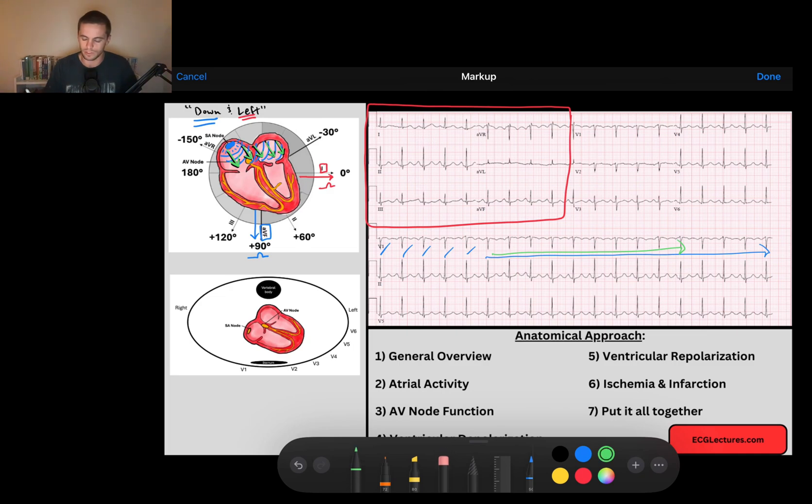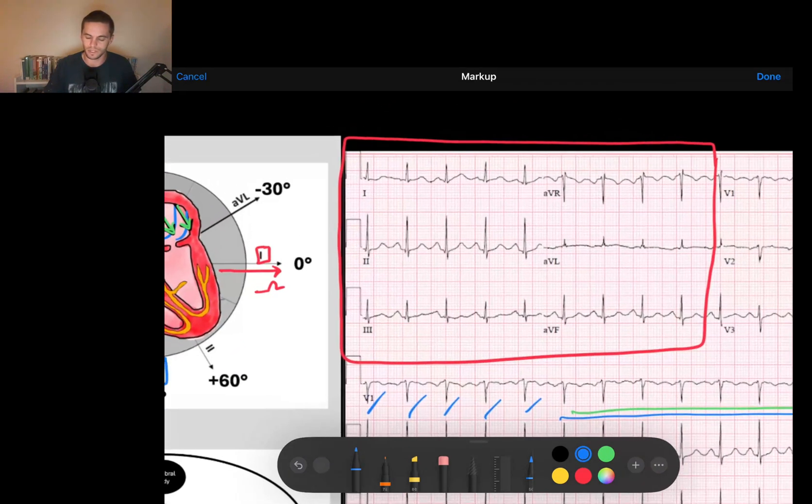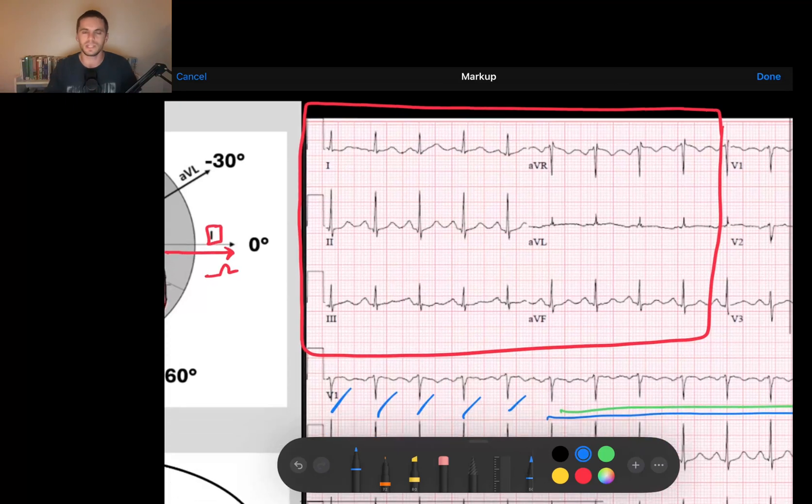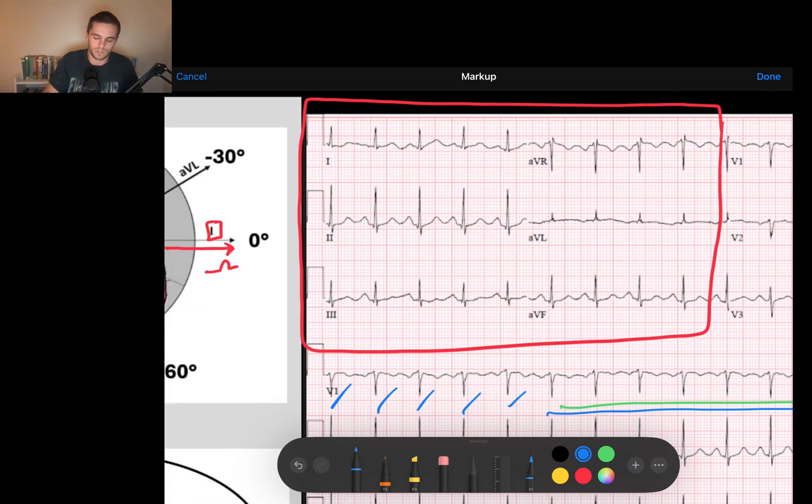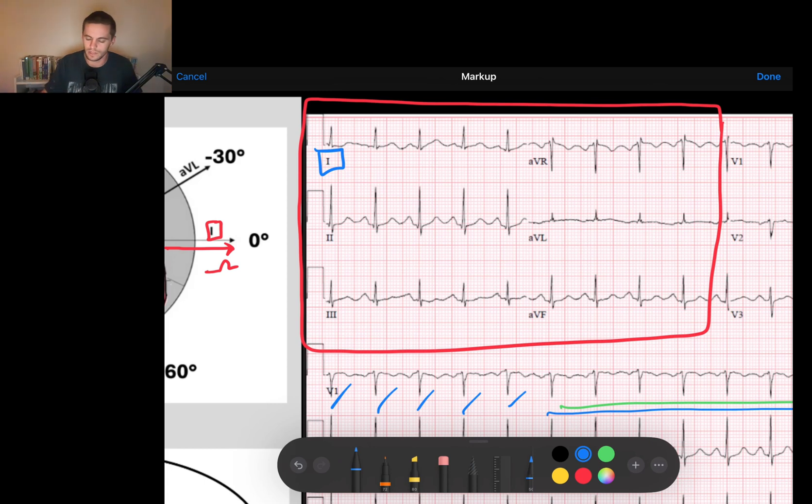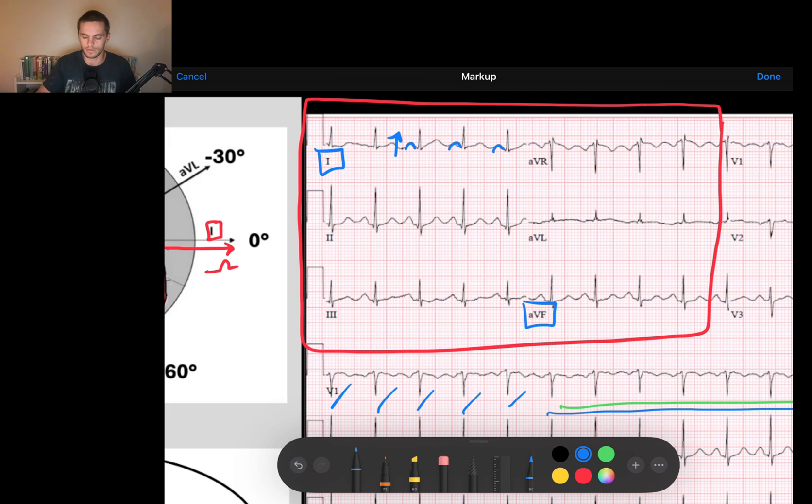We see that we have a nice regular rhythm. And now let's analyze our P waves. We said that P waves are going down to the left, and that would be up in leads 1 and AVF. So I come here, I see and identify lead 1, identify lead AVF, and I look at here and I see upright P wave, upright P wave, upright P wave. So my lead 1 P waves are upright.